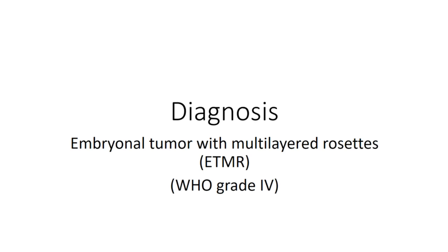The diagnosis is embryonal tumor with multilayered rosettes, ETMR. We did not confirm the C19 amplicon in this particular case, so strictly speaking it should be 'not otherwise specified,' but it is almost certainly present. These are very aggressive tumors with a predilection for young children. They can have many different patterns. This pattern was previously described as 'embryonal tumor with abundant neuropil and true rosettes' (ETANTR) by Berger and Eberhart. The ETMR category now encompasses other tumor patterns including medulloepithelioma, which share the same C19 amplicon.